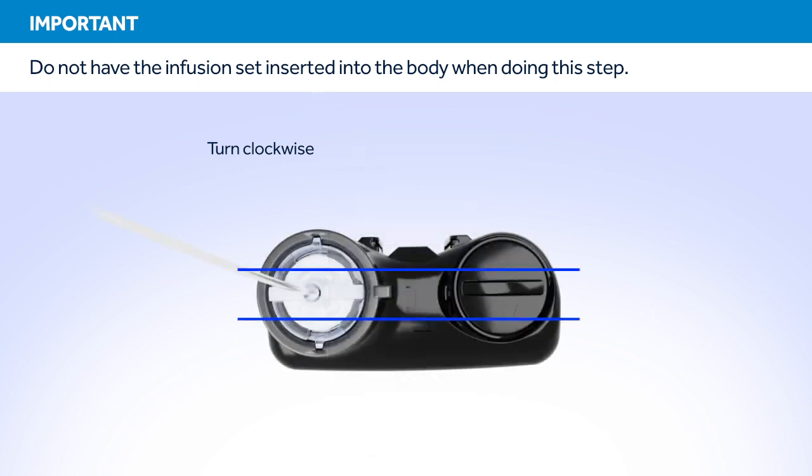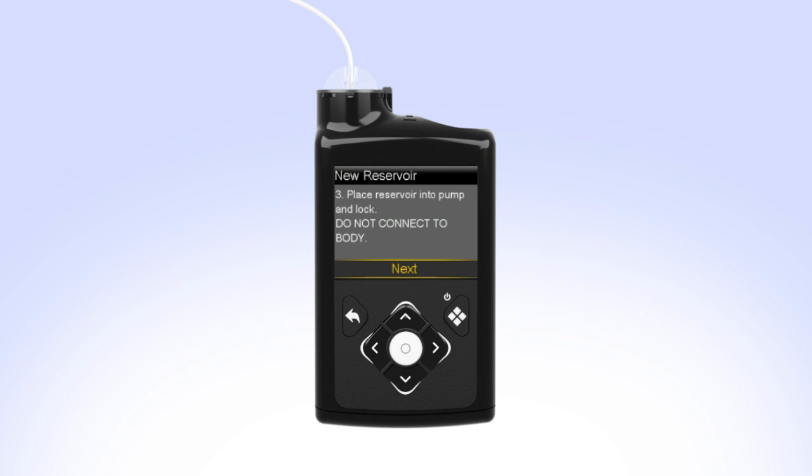The tubing connector should line up with the groove in the battery cap of your pump. On your pump, select Next to go to the Load Reservoir screen. With Load highlighted, press and keep holding Select until the screen shows Complete. When you see Complete, Do Not Connect to Body and a yellow checkmark on the screen, select Next.